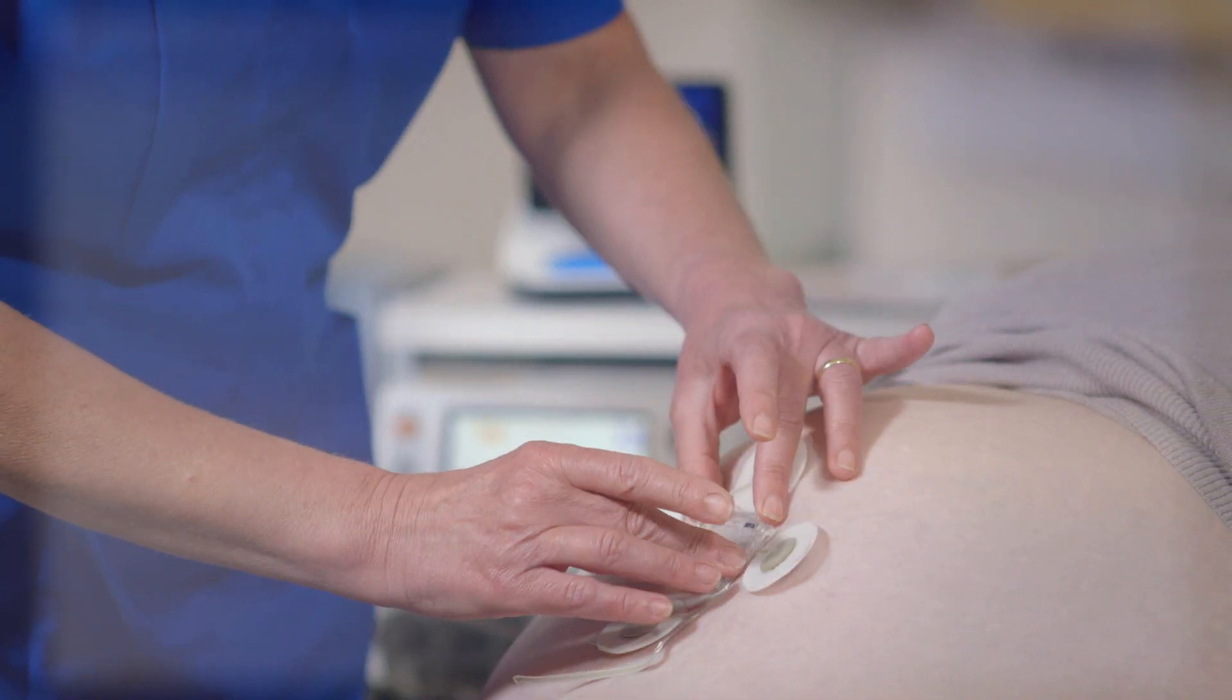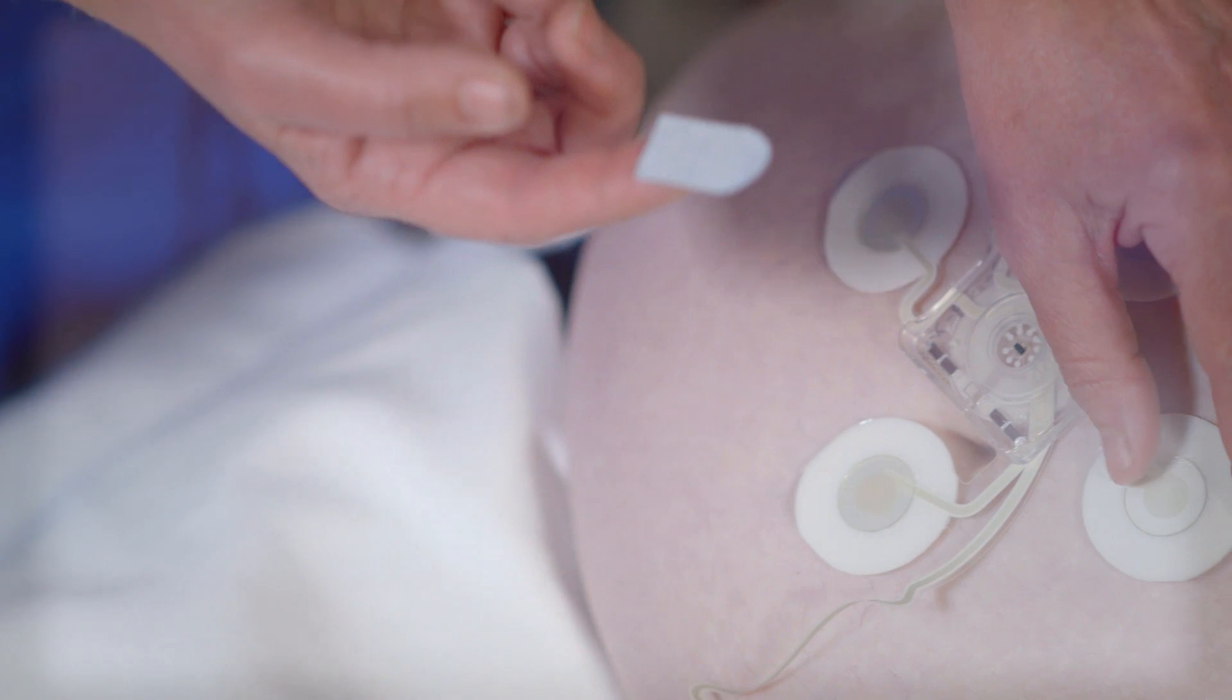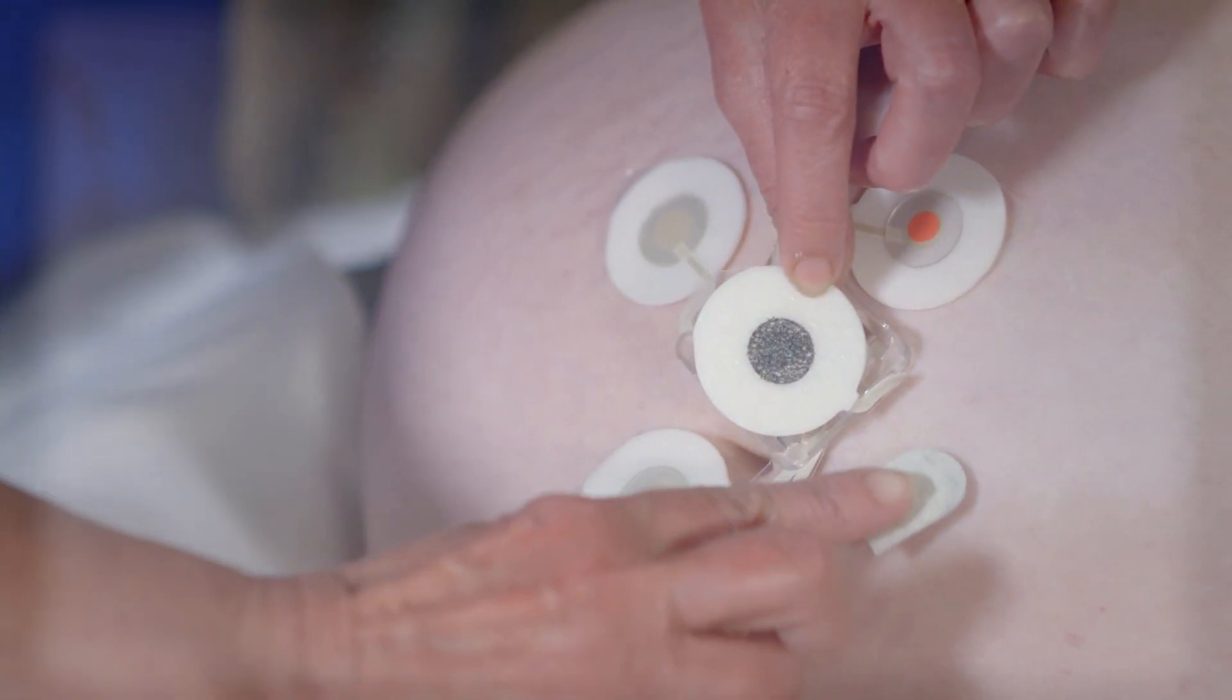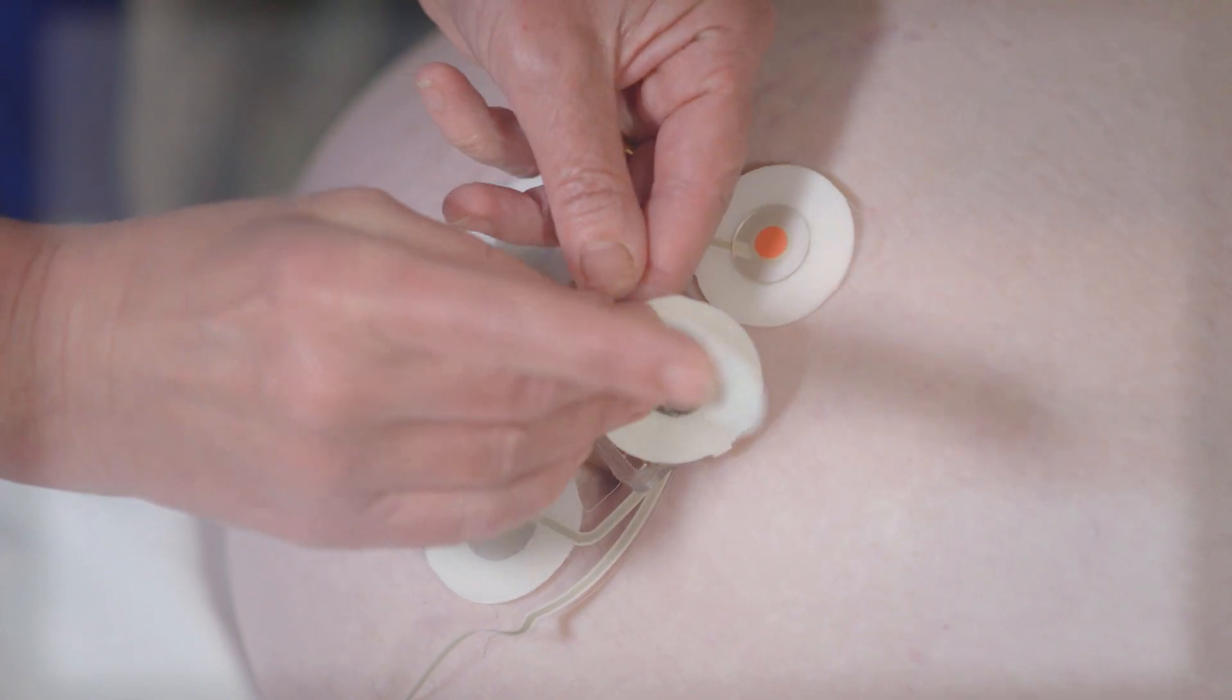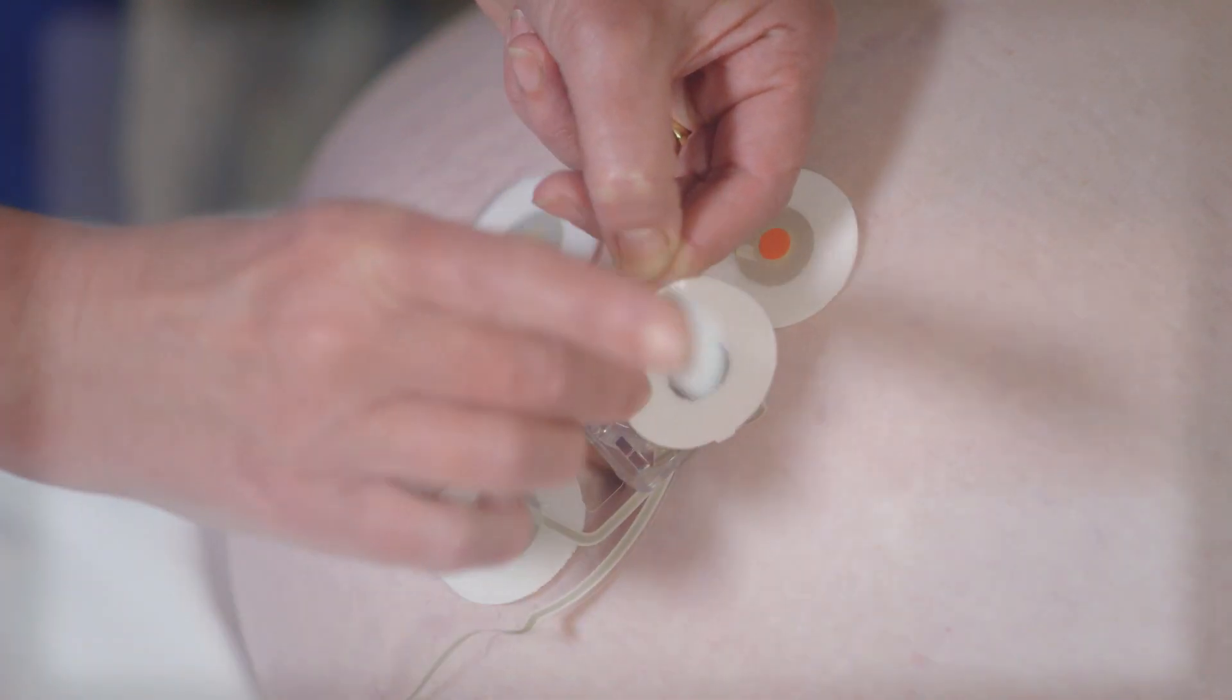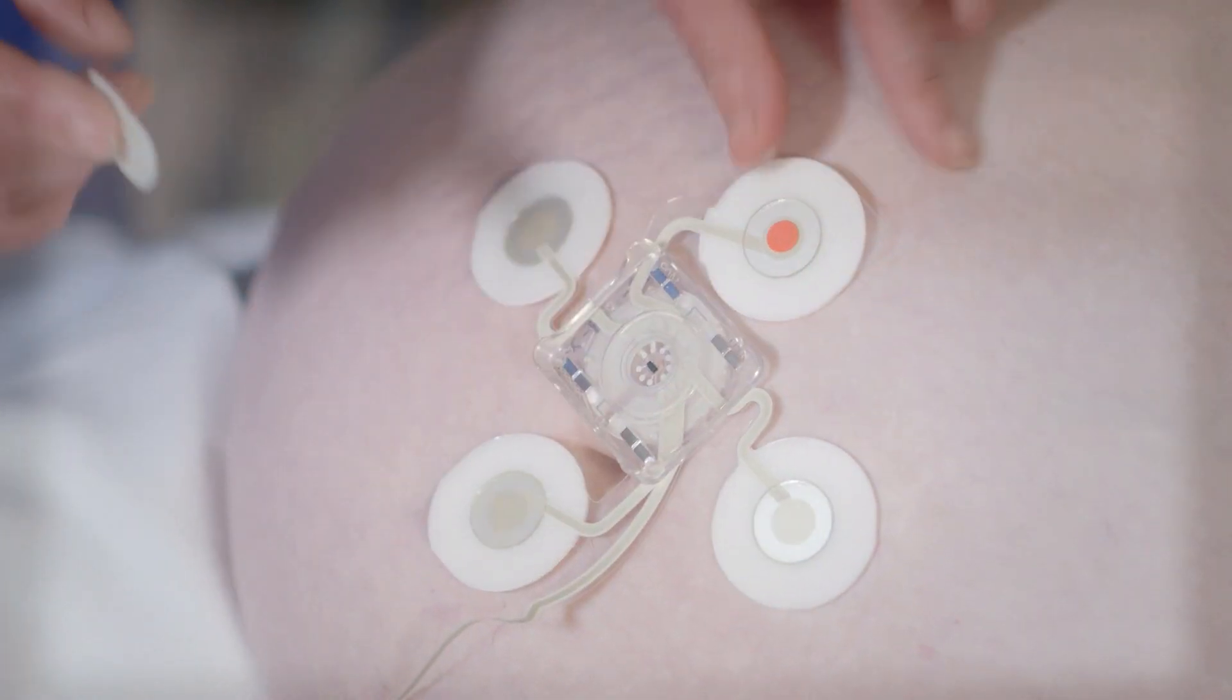With no leads, no belts, and no repositioning, our simple leadless peel-and-stick alternative to conventional transducers and belts is set to enhance the way you monitor patients, minimizing both cable and transducer cleaning and the risk of cross-infection.